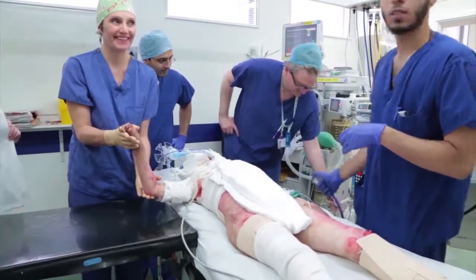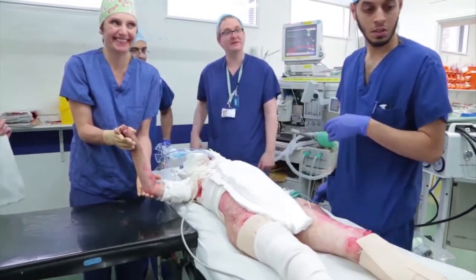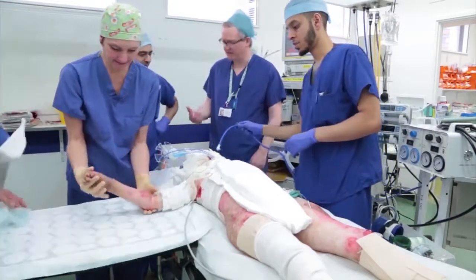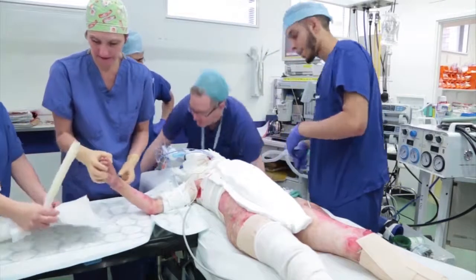The patient is still anaesthetized and is self-ventilating with normal tidal volume. The patient is extubated deep, the anaesthetic agents are switched off, and the patient rapidly awakes calmly.